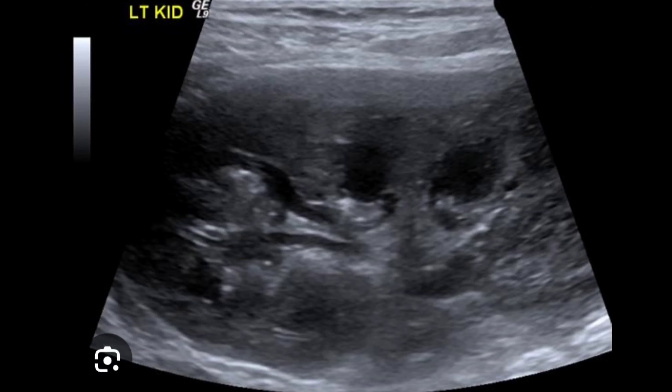This is a close-up ultrasound view. You can appreciate that these are truly parapelvic renal cysts. Especially in the upper pole, you can see cysts protruding into the renal sinuses, while others can also be seen protruding into the renal sinuses. This is how parapelvic cysts appear on ultrasound imaging.